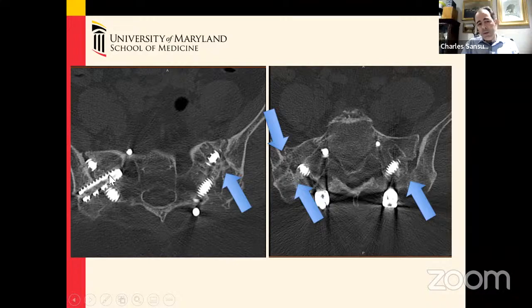You may also appreciate that one of the ileosacral screws was not removed. We were able to work around that particular screw and decided not to remove it because it had evidence of bone growth spanning the center of the screw. Furthermore, the outside was not easily reachable — bone had grown over it and through it. It would have been a challenging screw to remove because the star-shaped screwdriver insertion point was all filled with bone.